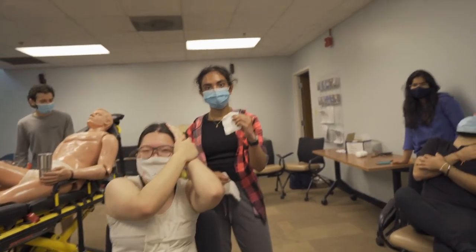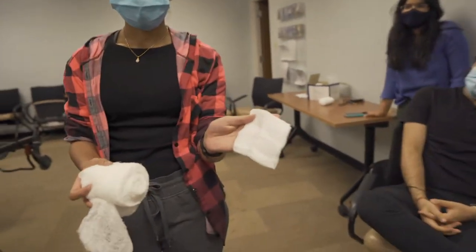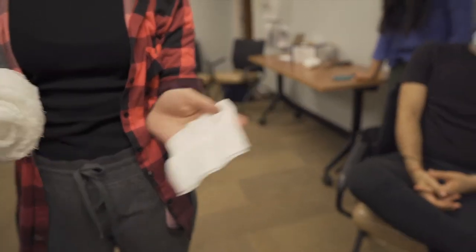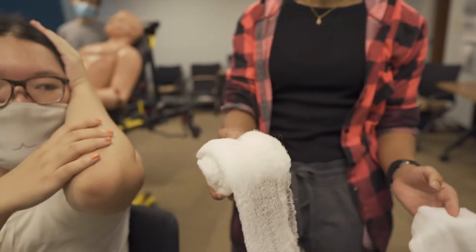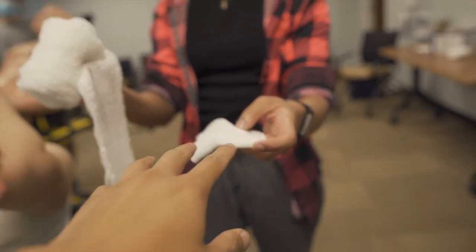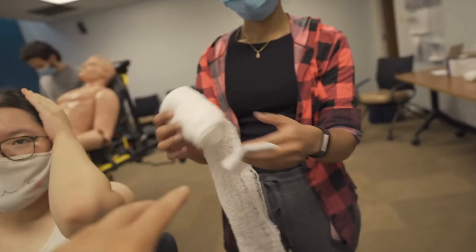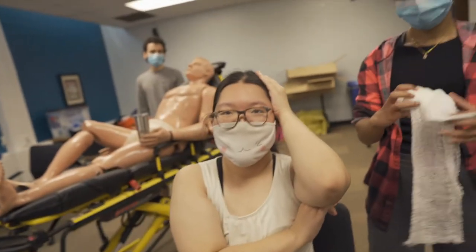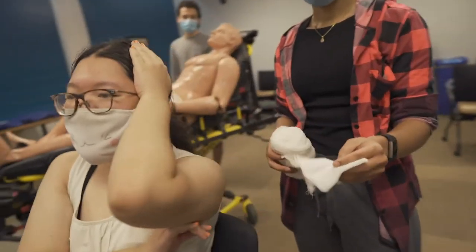Diane is going to specify how we differentiate gauze from bandage. So gauze is typically not unwrappable — it doesn't come in a roll. This bandage comes in a larger bulk that you would unwrap. We're going to use gauze to control the bleeding and use the bandage to wrap the gauze once the bleeding is controlled. If bleeding is still uncontrolled, we're going to pack more gauze on top of the laceration. Once it's controlled, we can utilize the bandage.